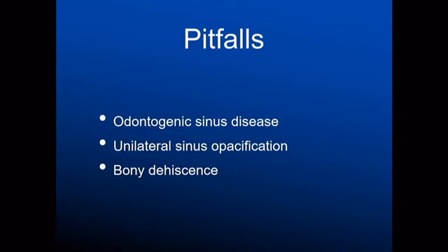Okay, so we're nearly at the end. Firstly, I really want to talk about some of the pitfalls in sinus imaging and show you a few cases in which it could have been easy to miss more serious pathologies.